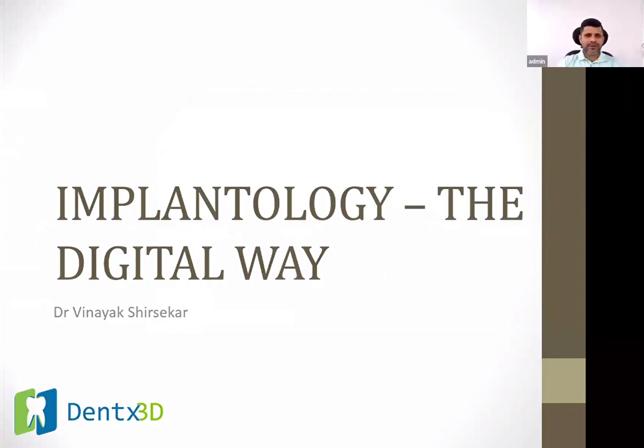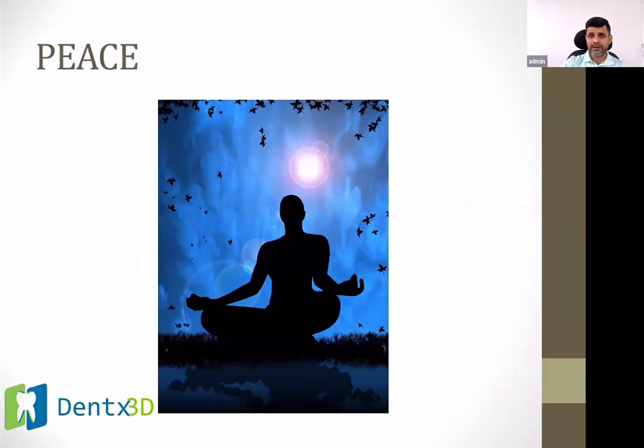Thank you, Dr. Rohan, for the introduction. Yeah, it's been a long journey now since 2006, I guess, that we know each other. And yes, we both have come a long way. So I will now start with CBCT and how to read it.